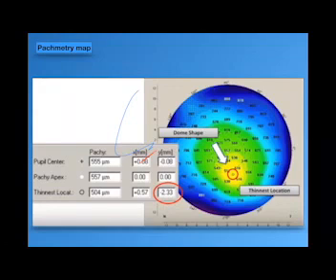The third point is the difference of thickness between the corneal apex and the thinnest location. The difference between both shouldn't exceed 10 micrometer. As shown in this figure, the pachy apex is 557 and the thinnest location is 504. The difference is too high, more than 50 micrometer between the apex and the thinnest location. This cornea is highly suspicious.